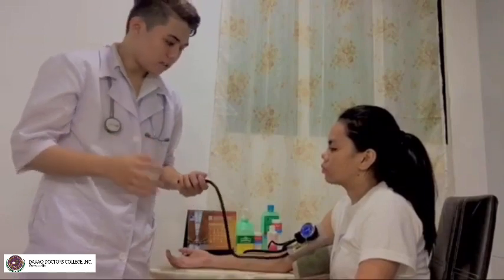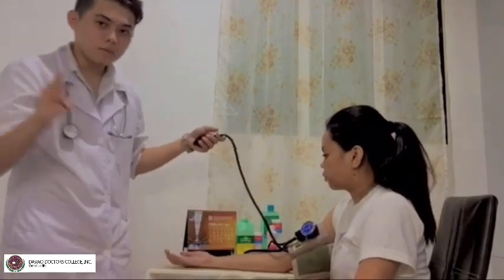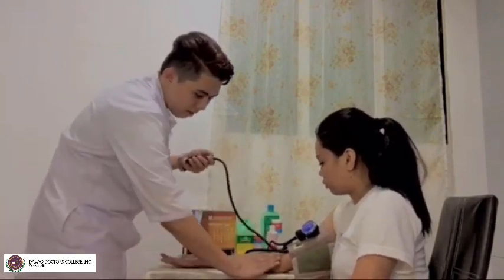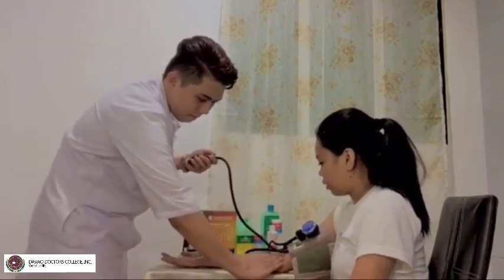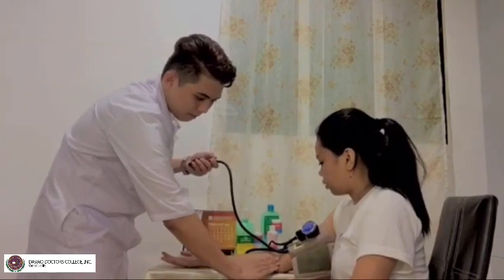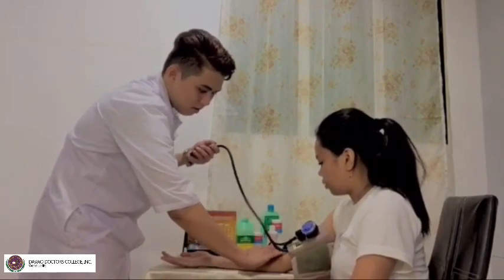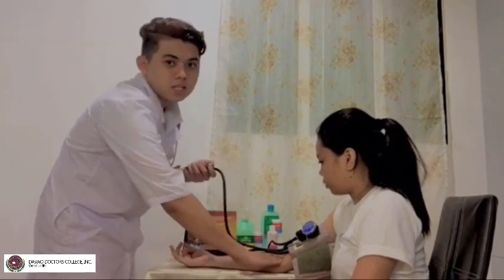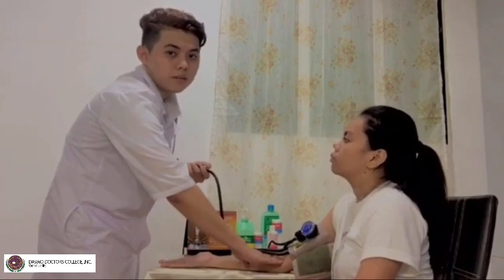So we need to palpate the brachial artery with the fingertips and close the valve on the bulb. So this is now closed, and I'm going to locate the brachial artery. Okay. Pump up the cuff until you no longer feel the brachial pulse.